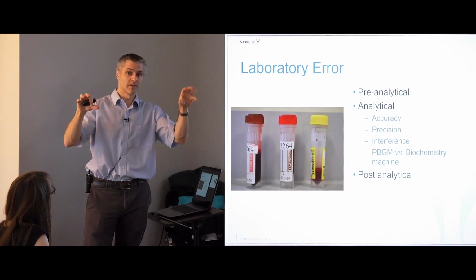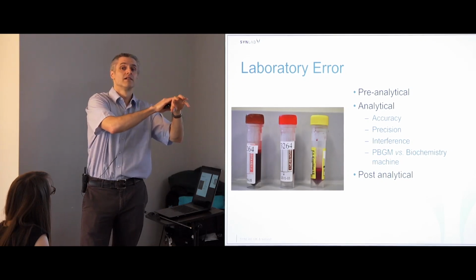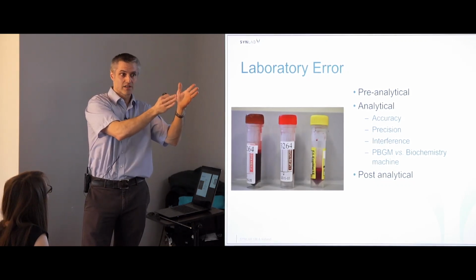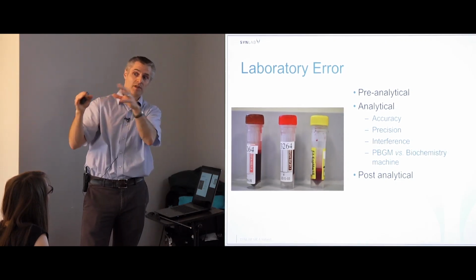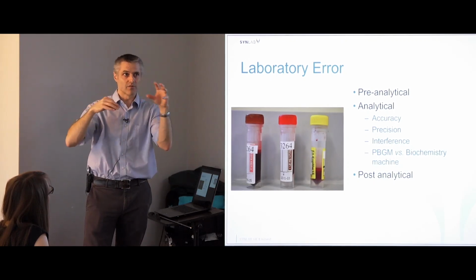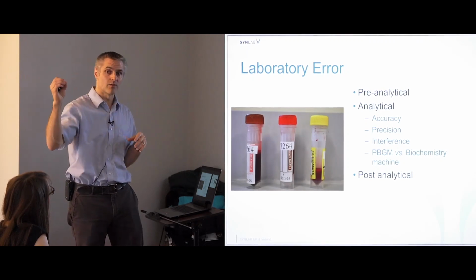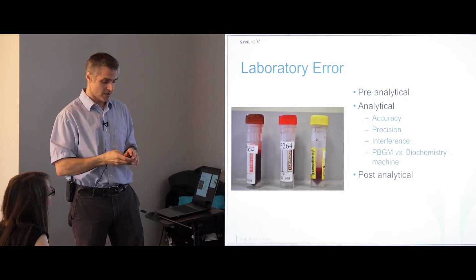So the glucometer makes an assumption about how much blood is there, as in how many cells. If your animal's anemic, the assumptions it makes are wrong. If the animal is dehydrated and has more red cells, the assumptions upon which it measures and calculates that glucose are wrong. Whereas plasma and serum aren't wrong, because they're less affected by cellularity. So be aware that the analyzer and the testing process make assumptions when you get a result. It's not just black and white, and too often it's overused and therefore misdiagnosed.